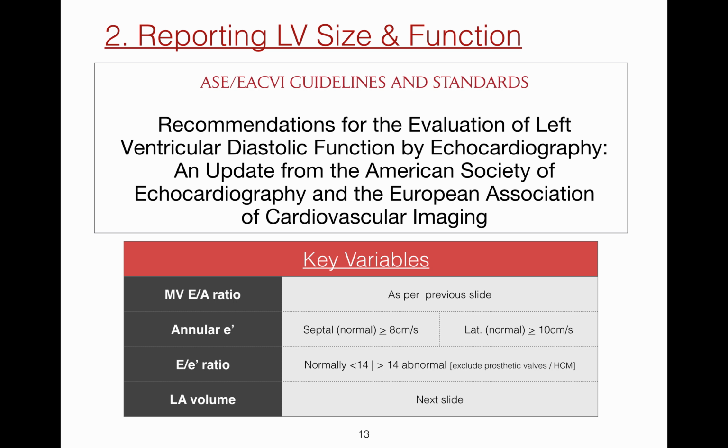There are two important points about this ratio. Firstly, the septal and lateral annular E' measurements should be averaged. And secondly, this value is not valid in patients with prosthetic valves or hypertrophic cardiomyopathy.